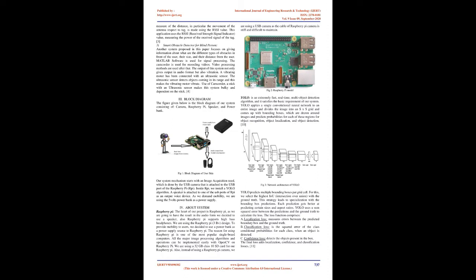The key contributions of the paper include robust and efficient object detection and recognition for visually impaired people to independently access familiar and unfamiliar environments and avoid dangers. Offline text-to-speech conversion and speech output. 2. Related work. 1. Real-time objects recognition approach for assisting blind people.